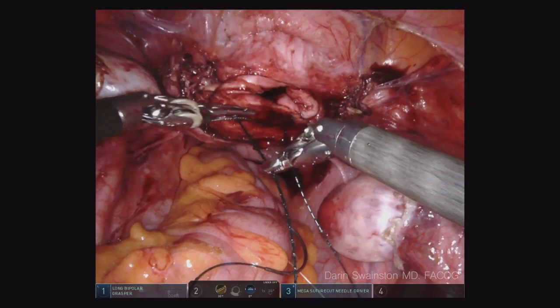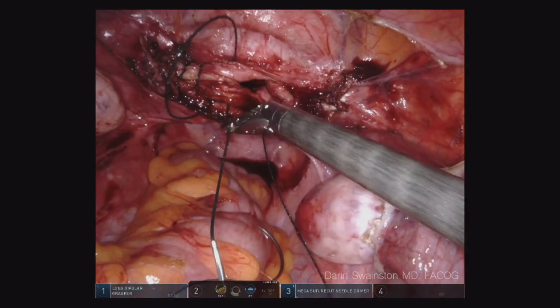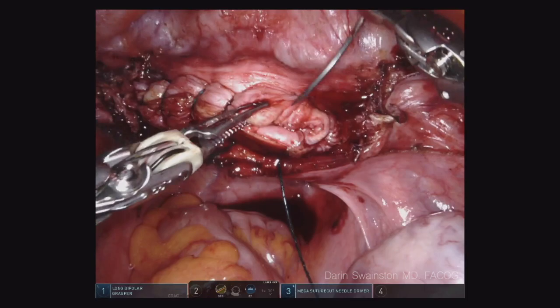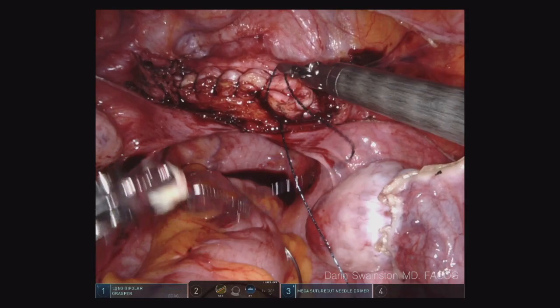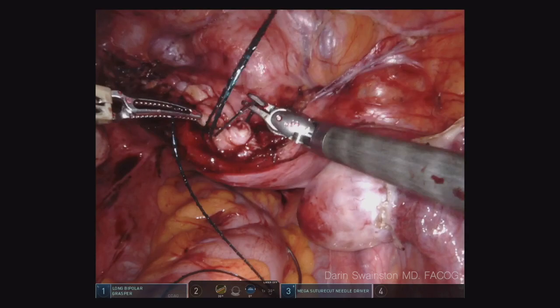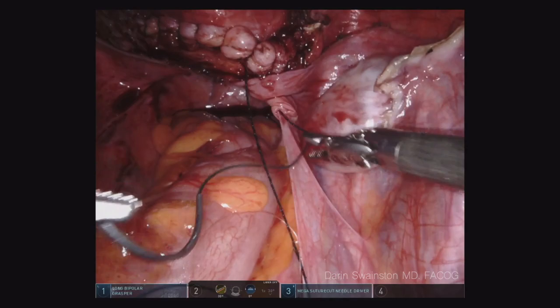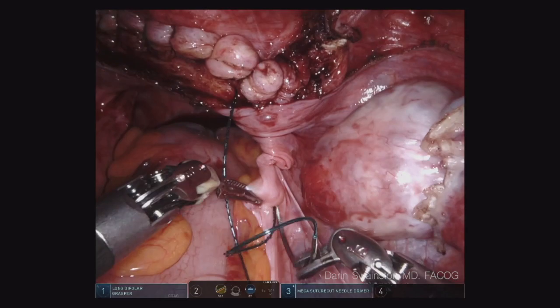If you pay close attention, you'll see that I am not incorporating the pubocervical fascia or the uterosacral ligament or rectovaginal fascia — this is really just vaginal mucosa. On my second layer closure, we will incorporate that. So as the vaginal mucosa is healing, it will be healing under its own suture line and there will be no tension from intra-abdominal pressure on it because of the second layer closure.